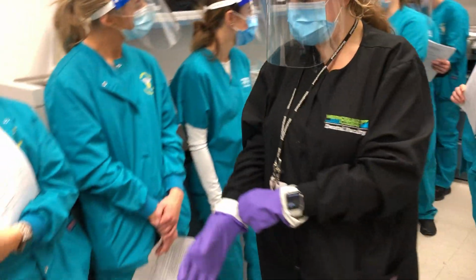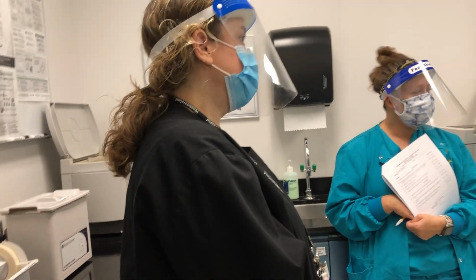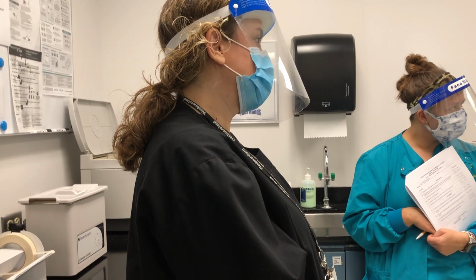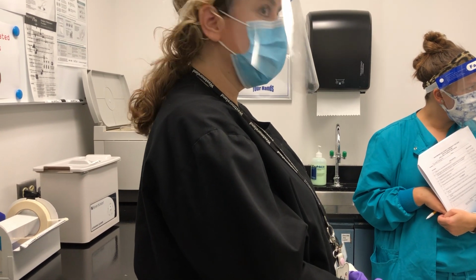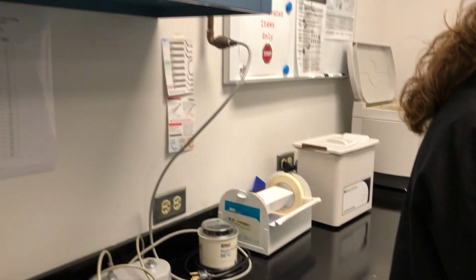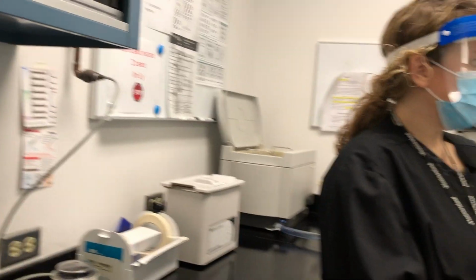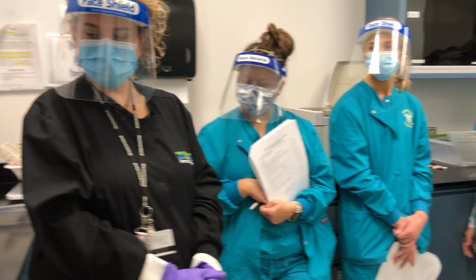How do you know it's the normal and it's not biohazard also? There's no biohazard sign. How do you know that Mrs. Coonrod put the contaminated areas and the contaminated items in the right place? Because this is a huge room. Why didn't she put them over here, behind me? That's where everything is sterile and clean. Yeah, clean area, like the signs say, this means clean. Over here, actually, it says clean, but those are sterile. And what's the sign behind Mrs. Coonrod say? Contaminated. So that's why we start there and it makes a slide through.